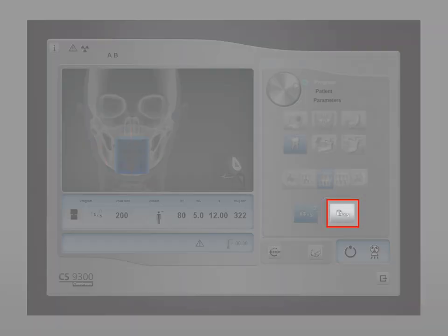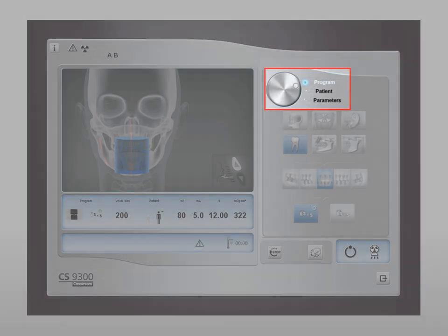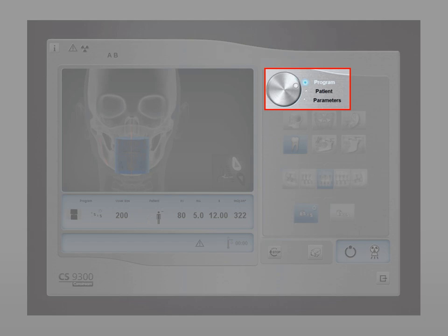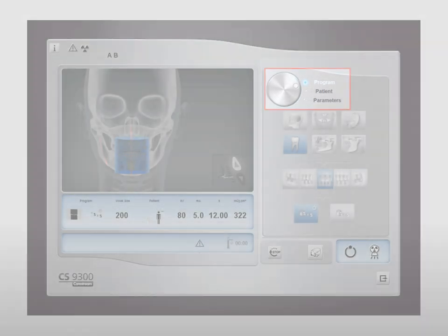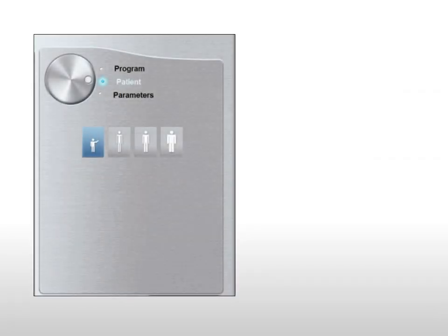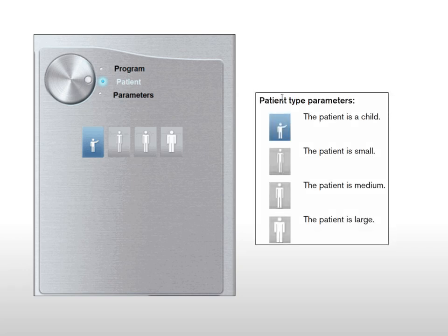Or select the 5x5 high quality acquisition button, which is a longer acquisition time with more projections for maximum quality resolution. Next, click the patient button and select the patient size. Selection of the patient parameters determines image quality and correct positioning of small field of view images.